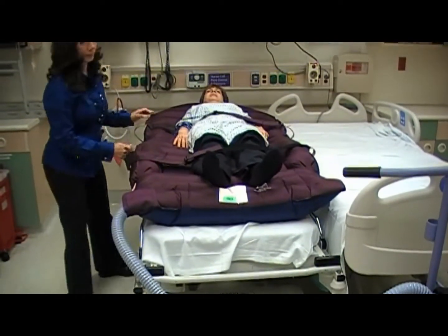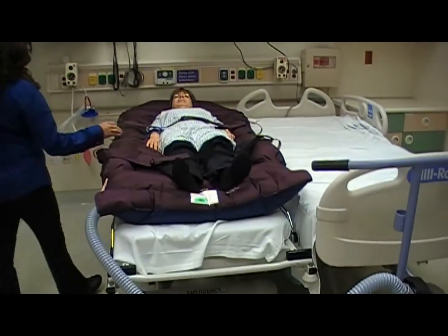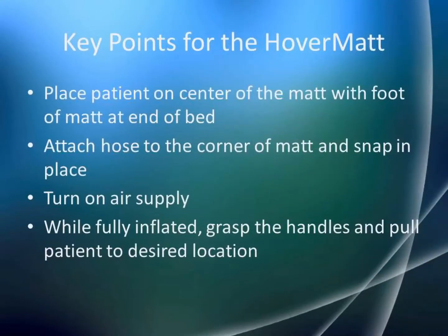Turn off the air supply and mattress will deflate. Use the roll technique to remove the mat. Never leave a patient unattended on an inflated mat. Patients can be left on a deflated mat without concern for skin integrity.